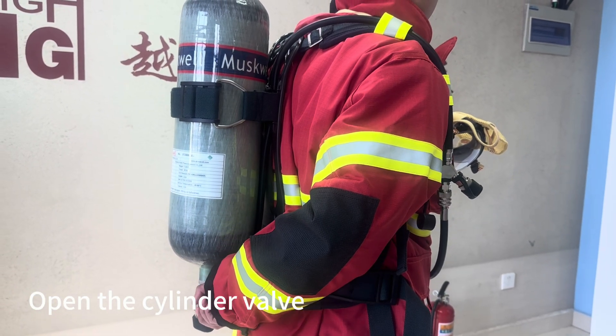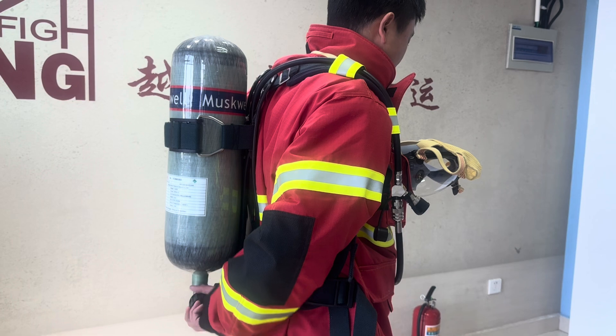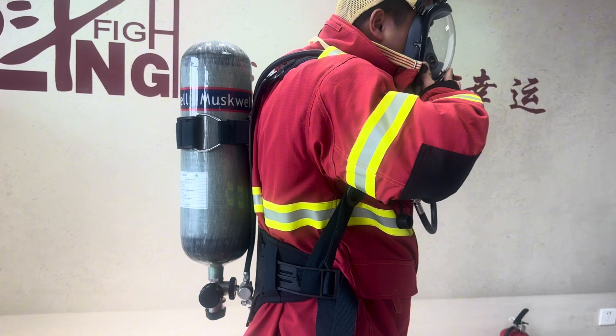First, we need to open the cylinder valve, turn the handles, and try to wear the mask and try to breathe.